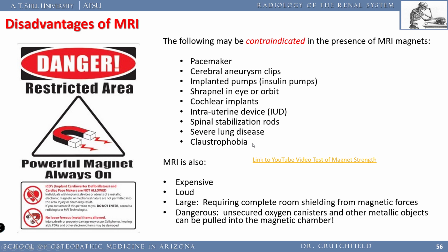And here's probably the biggest. This is probably the biggest problem that I had in practice with an MR scanner. If you've never had one, they're crazy claustrophobic. They fit around you really tight. And a big guy like me, when I got in there and had my head scanned, they give you headphones and you turn on the rock music and that helps, and you close your eyes. But if you open your eyes and you realize that you feel like you're buried alive because these things are pretty claustrophobic, you would do a good deed to give your patient a prescription for anti-anxiety medication before they have their MRI if they're claustrophobic.